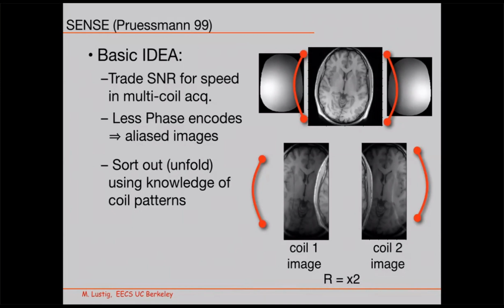It's a Fourier measurement coming from different coils, and each one of them illuminates the sample in a different way. That gives you the possibility of using those coil sensitivities as part of the reconstruction in order to reconstruct the unweighted image, with perhaps a fewer number of Fourier encodes.